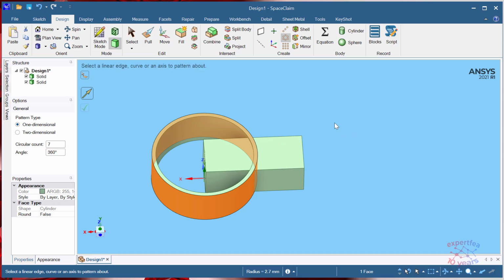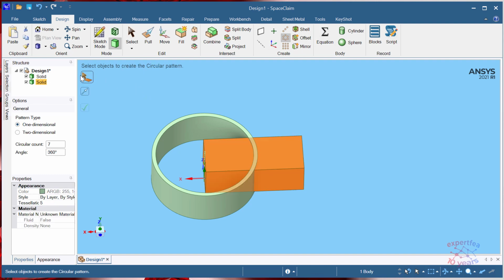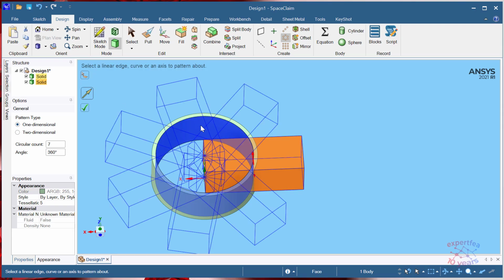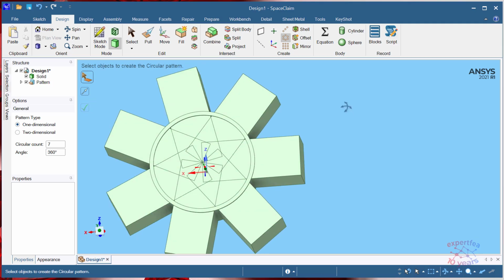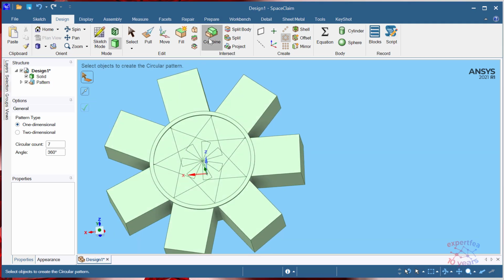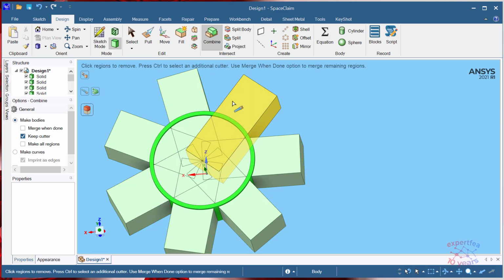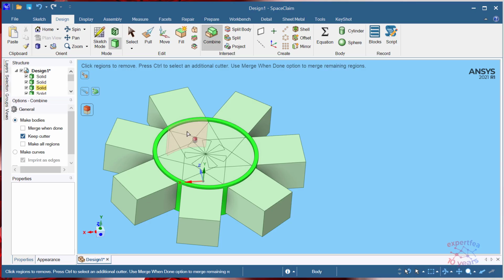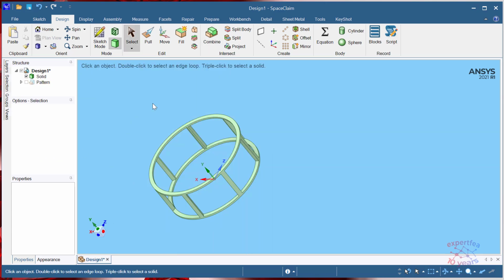Click or select objects to... Okay, maybe I went too fast. Let's do the combine operation again. Cylinder is the target, then these are the cutters. Let's remove the remaining windows and hide the pattern.